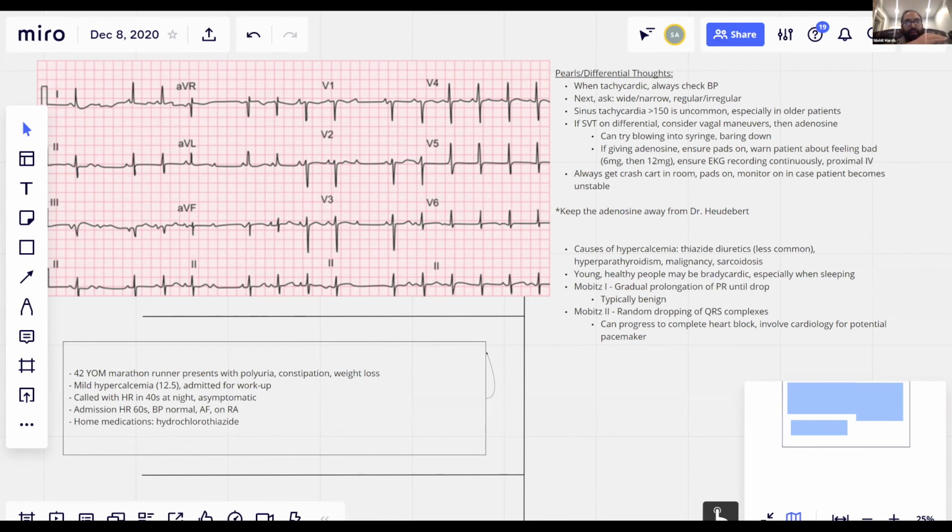But if you saw that immediately there was just a 90-degree angle going up to 150 when initially the heart rate was fine, that pushes you more into that PSVT scenario. So another takeaway I would give for everyone is, if the tele is there, use it and learn to use it well.